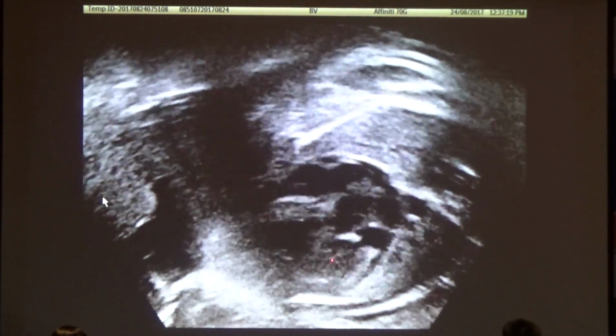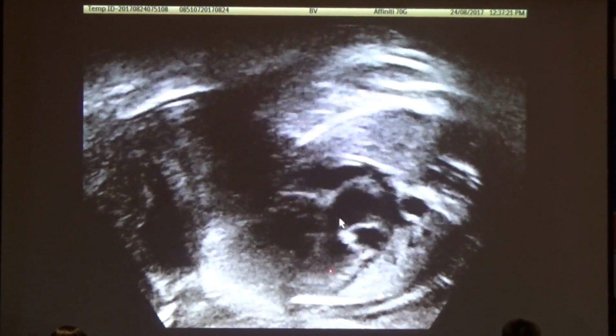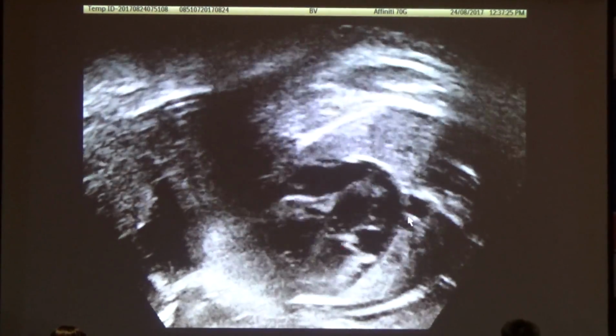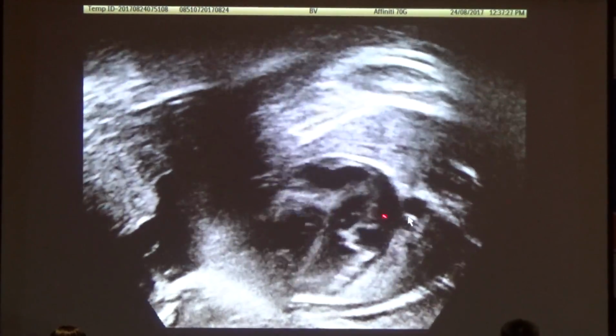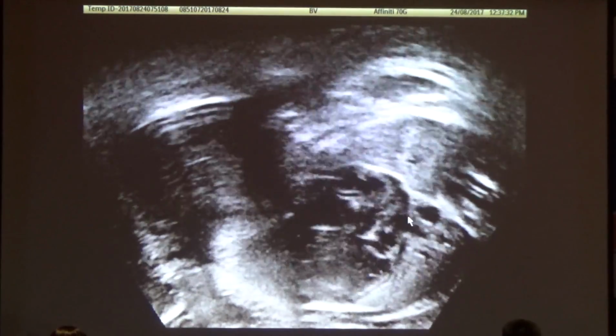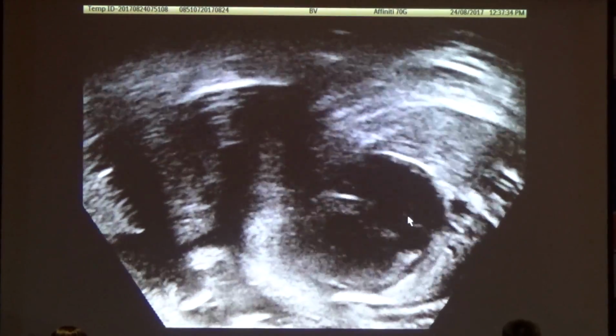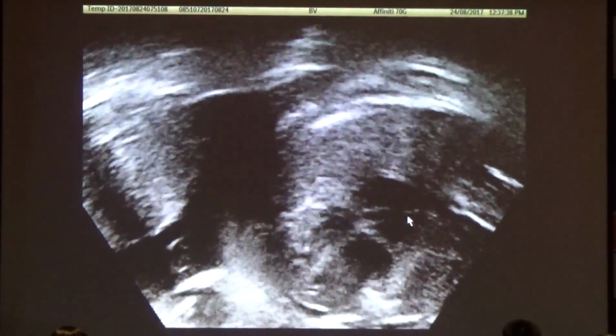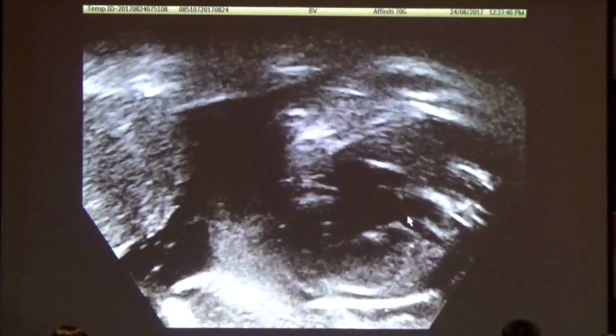Yeah. This is the left ventricle. And coming off the left ventricle is a vessel that bifurcates and goes to the back. Now I want to come up a little cranial. Not easy to see that here, just on this angle.